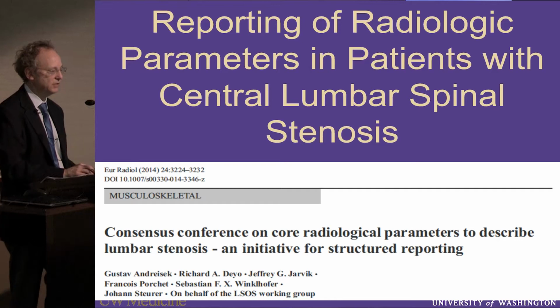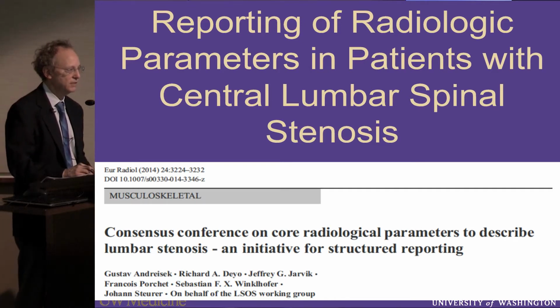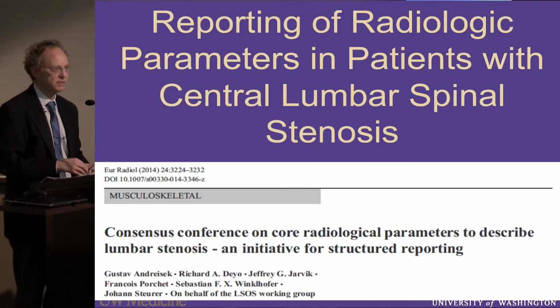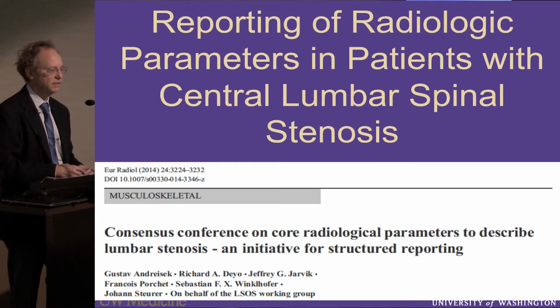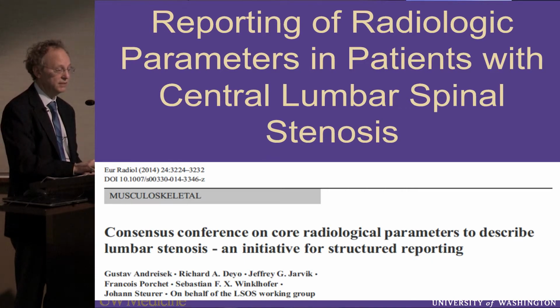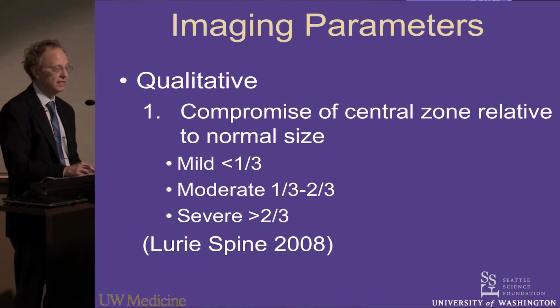Let me talk a little bit about stenosis. There was a consensus meeting that occurred in Switzerland probably over a decade ago. It was published in 2014, but maybe it was about 8 or 9 years ago. This was a multidisciplinary conference that got together and talked about central stenosis primarily and how it should be reported. And the bottom line is that, again, simple is more reliable and more widely usable.